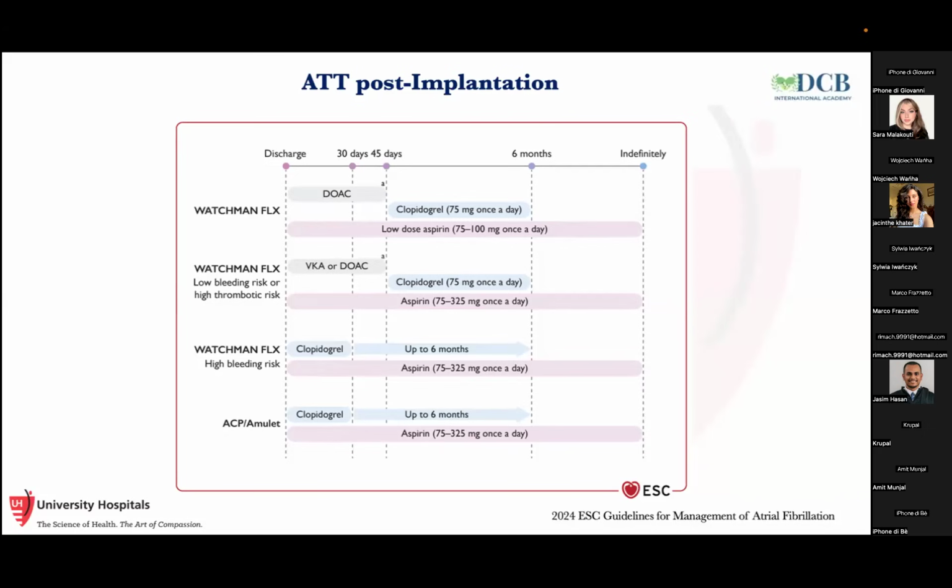So it was thromboembolic events and device-related thrombosis at 3 months. They had many problems with COVID, so they had to interrupt the inclusion. It was a randomized clinical trial published in JAMA as a correspondence. But I think there is also a nice meta-analysis published about 1 year ago in JACC. Unfortunately it is based only on registries and small observational trials, but it seems to support the evidence that low dose DOAC performs better than any antiplatelet therapy.